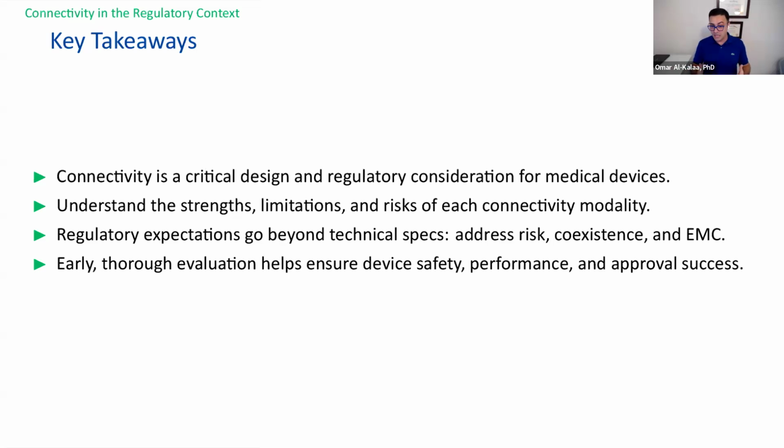And again, just like any other topic related to medical devices, think early and try to plan how you're going to demonstrate safety and efficacy down the line. And at this point, assuming that you've done all of the above adequately, you have a connected device, and you should start worrying about how to secure that connected device. And here I hand it over to Naomi.